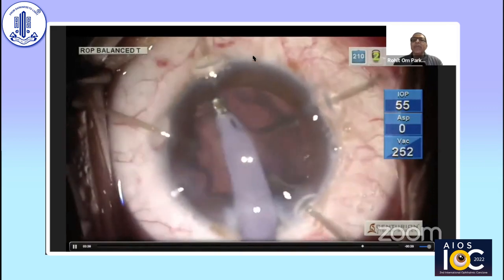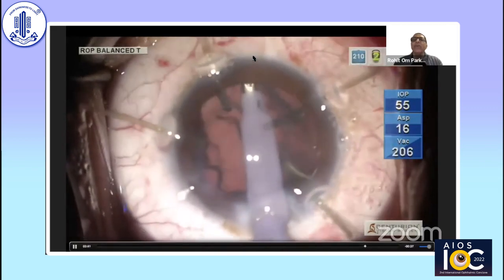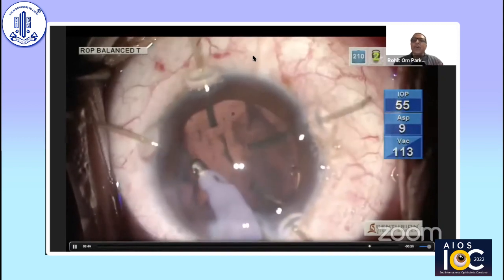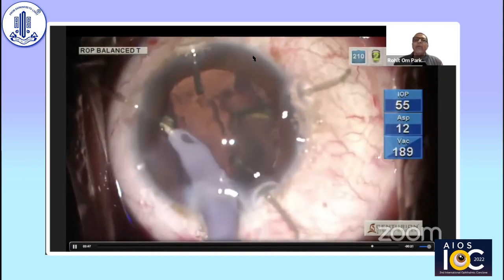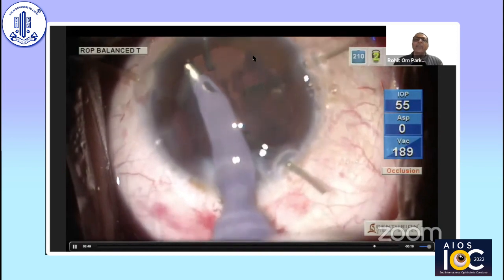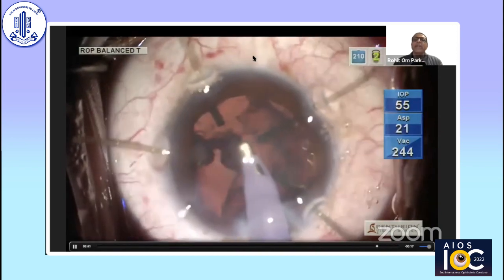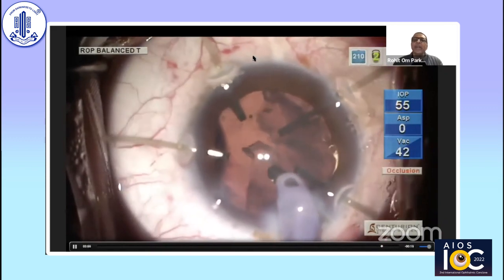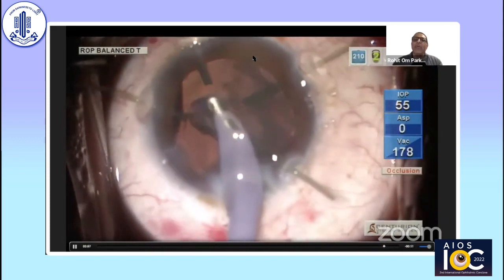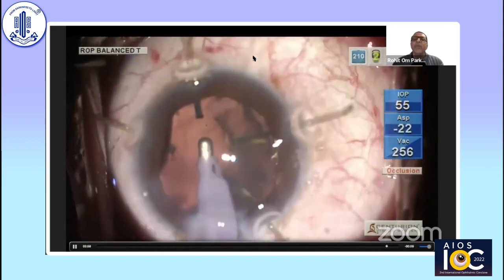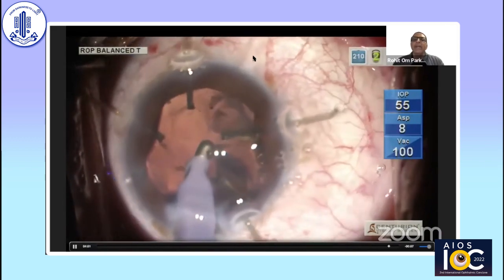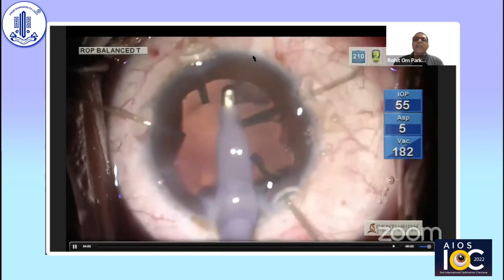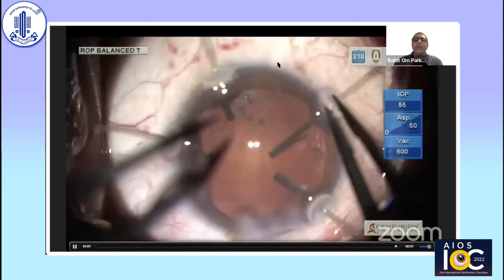This last pearl is how to do irrigation-aspiration in these patients. Tangential stripping is the answer — you have to start in the area where the zonules are intact and continue from there. The vacuum is not on the higher side. At times when you are not able to do that, you can do reverse stripping by holding the posterior lamella and bringing it out. Here is the last cortical piece being removed.